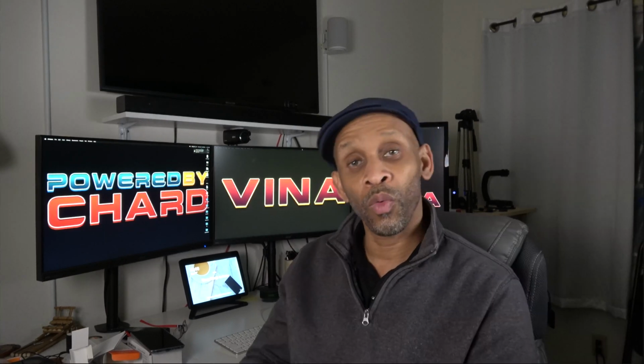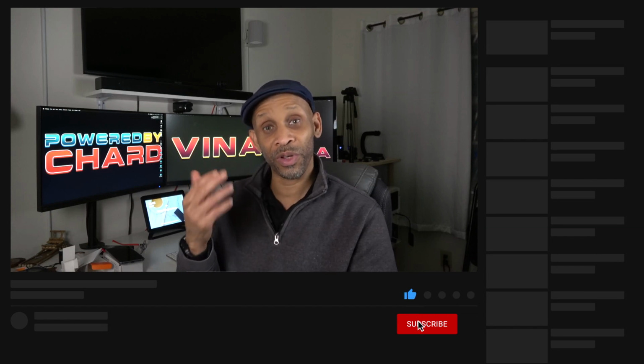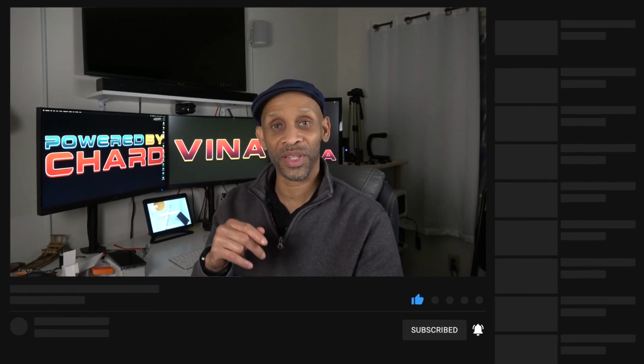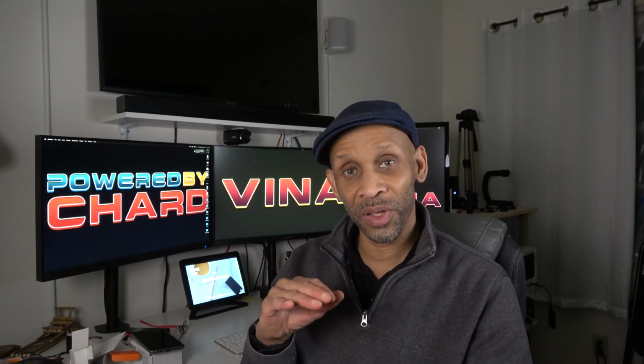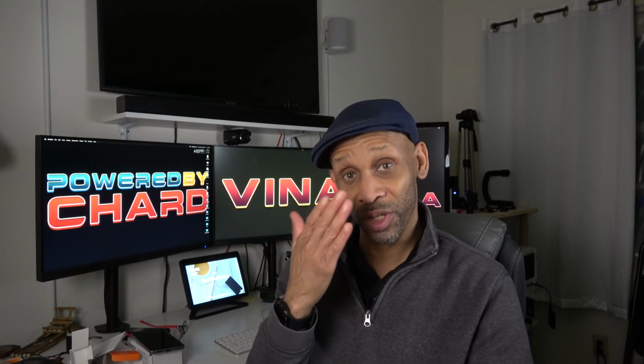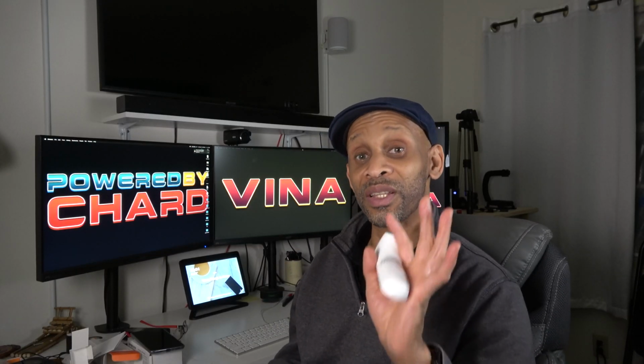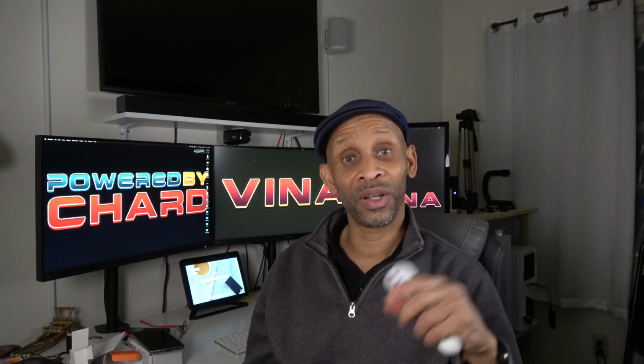You'll be all right. Oh, one more thing. It buzzes when it reads your temperature, and it usually does that in maybe 1.5 seconds. So if you're not feeling the buzz, then you need to go closer to the skin. If you're too far away and you try to press the button, it won't buzz. So the closer you get, you'll feel that buzz, and you'll know that you checked your temperature. See that? 97.3.